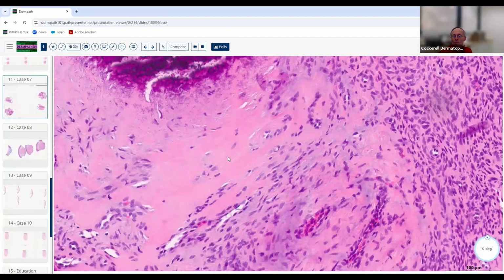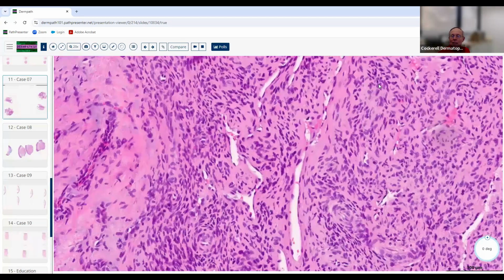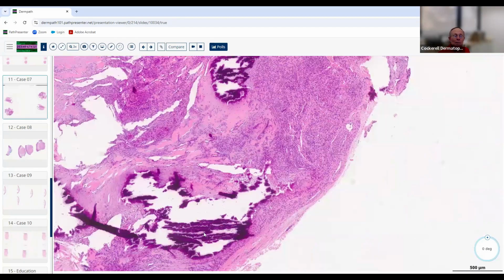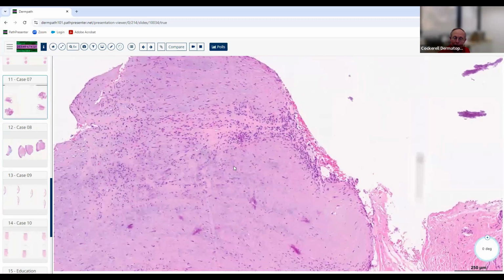Yes, this is a juvenile, or it doesn't have to be juvenile, but in this case, it was a juvenile myofibroma. And this is a relatively rare entity. Probably the key to the diagnosis is recognizing this. First of all, this is one of those see one, remember it, never forget it kind of things. But you do very classically get this amorphous bluish gray mucinous-like material, which is kind of funny to get in a lesion with muscle differentiation.